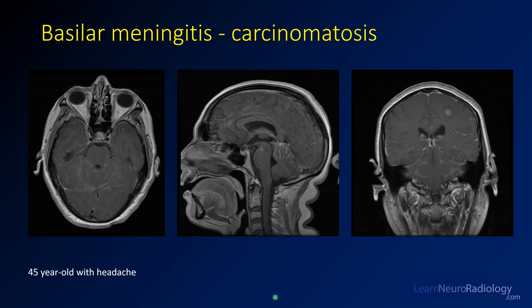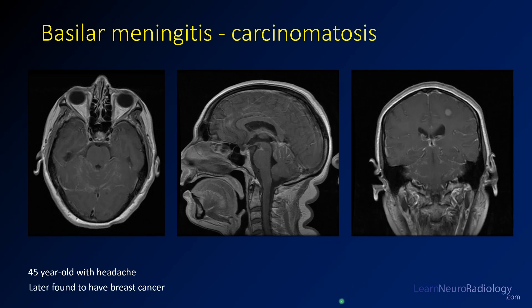Here is another basilar meningitis case. On axial post-contrast images there is very thin leptomeningeal enhancement along the folia of the cerebellum, confirmed on sagittal imaging with enhancement in the interpeduncular cistern, along the surface of the pons, and coating the superior cerebellum. Coronal imaging confirms this and also shows a parenchymal nodule. This was a 45-year-old with headache who turned out to have breast cancer — leptomeningeal carcinomatosis from metastatic intracranial disease.